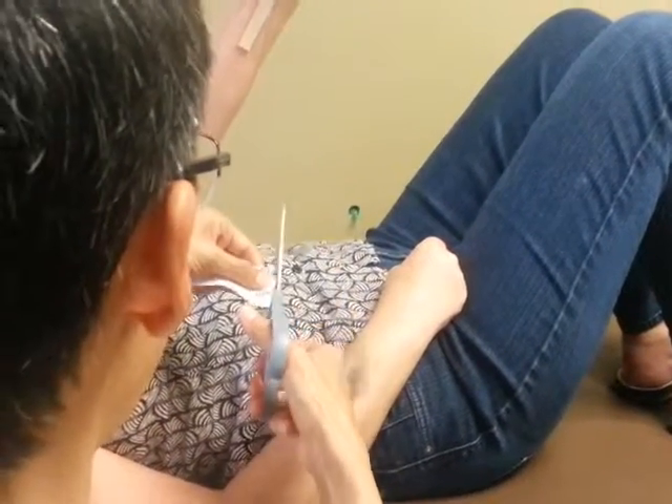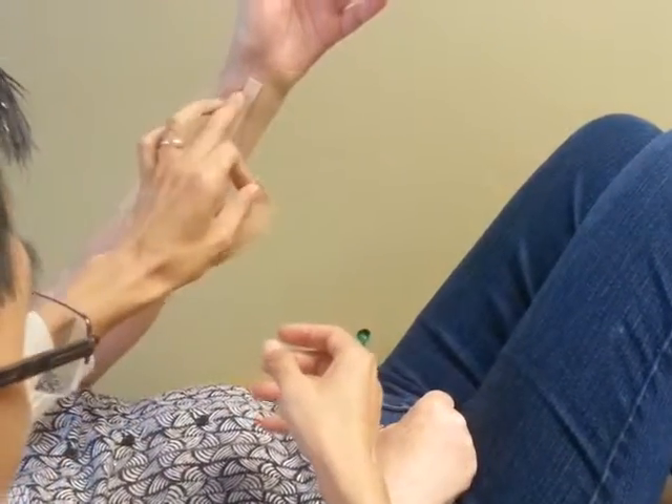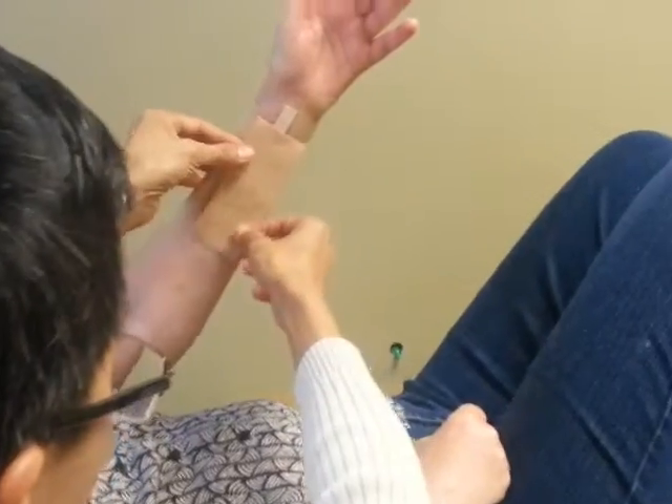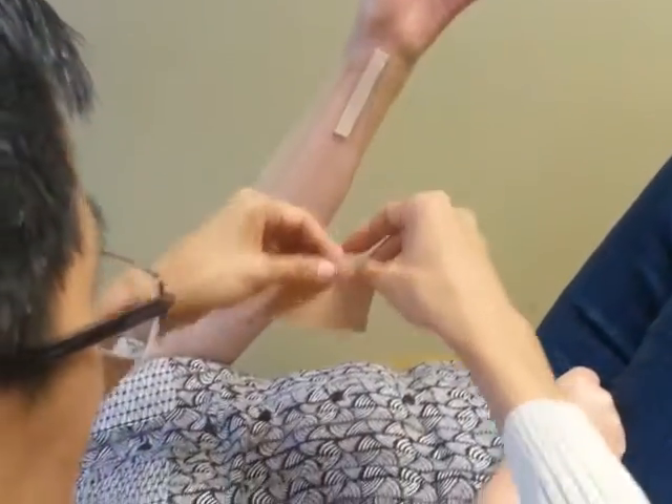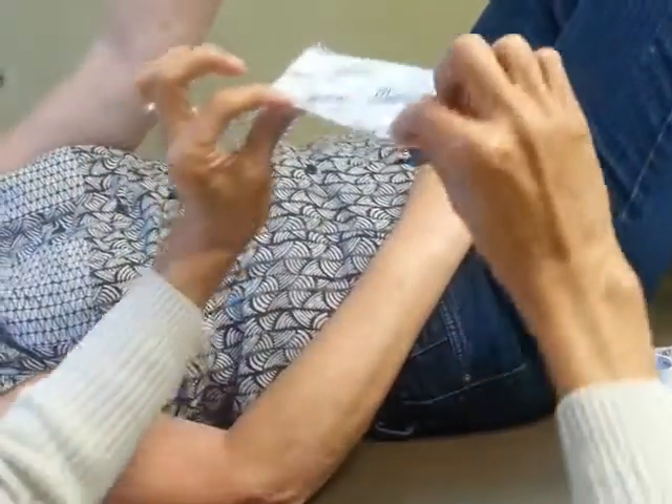You'll see that it starts off — we're going to go like this, right over that. Typically this won't be over skin like this, but it doesn't stick as well when you have this covering. This is for demonstration purposes only. You always want the ends not to have any stretch at all.